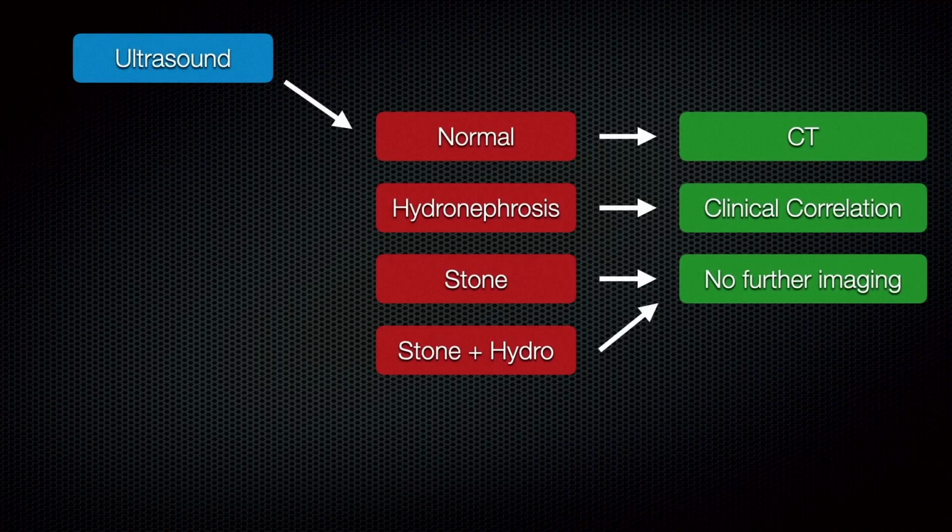What I've discovered in the course of looking into this and practicing is that ultrasound, and it's tough to say as a sonophile, is not the perfect test. But when applied with an eye towards some evidence-based practice as well as some pragmatism, it can be a very helpful test and won't completely obviate the need for a CT scan, but it will certainly decrease that need in a select cohort of patients.